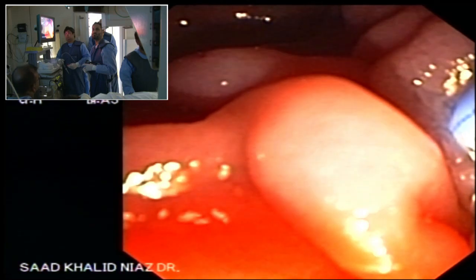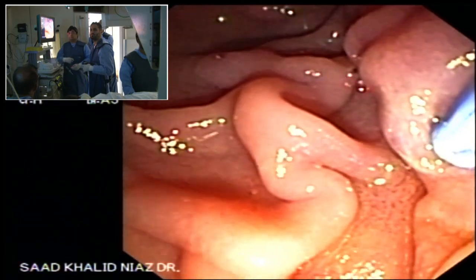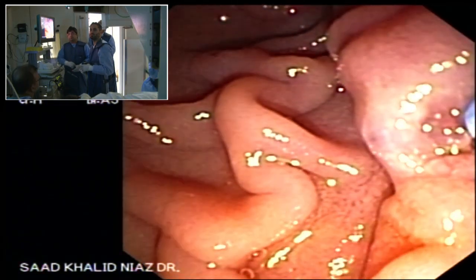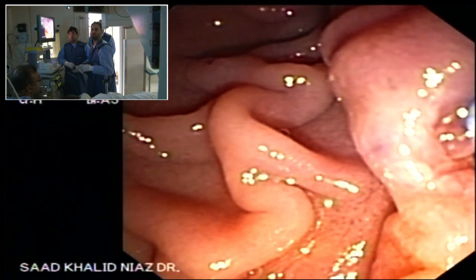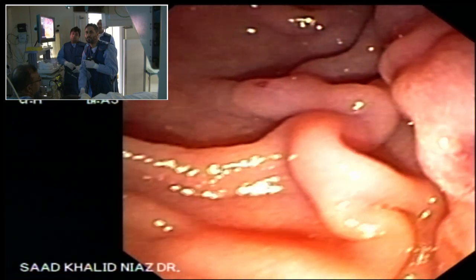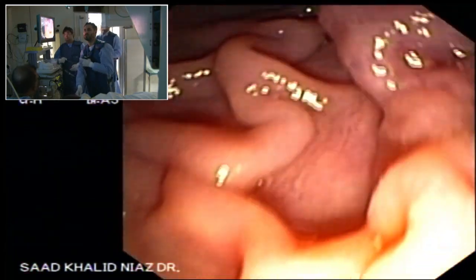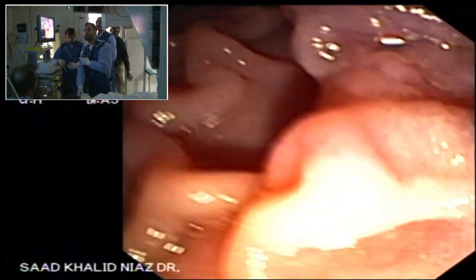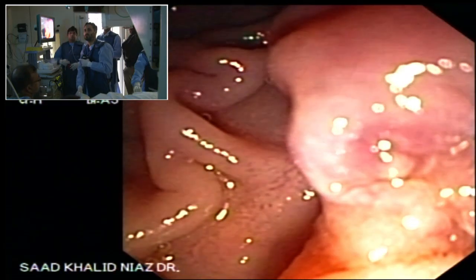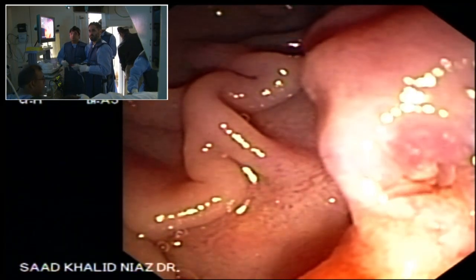Here, locking the small wheel still wouldn't be helpful to you, because if you look at the simple physics of it, your cannula is not pointing in the direction of the CBD. So you have to unlock it to get into a better position. You can't cannulate in this position. You have to improve your position. That's the first wheel.